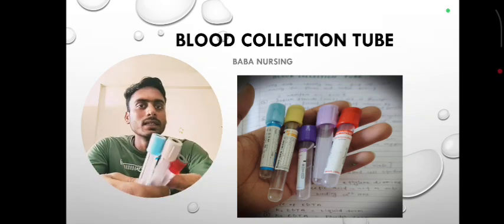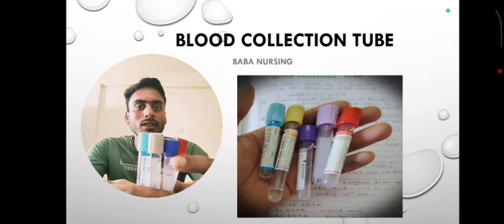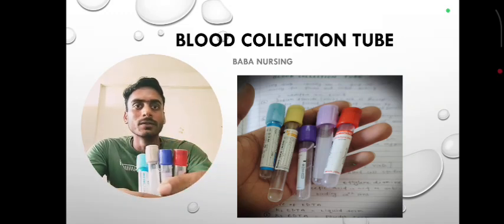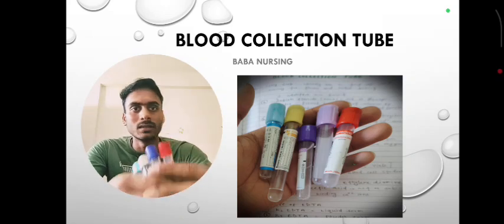So I have just given a brief idea about the blood collection tube. Each blood collection tube, according to its color coding, has a different purpose. So in this video we will discuss this. Okay, let's start the video.